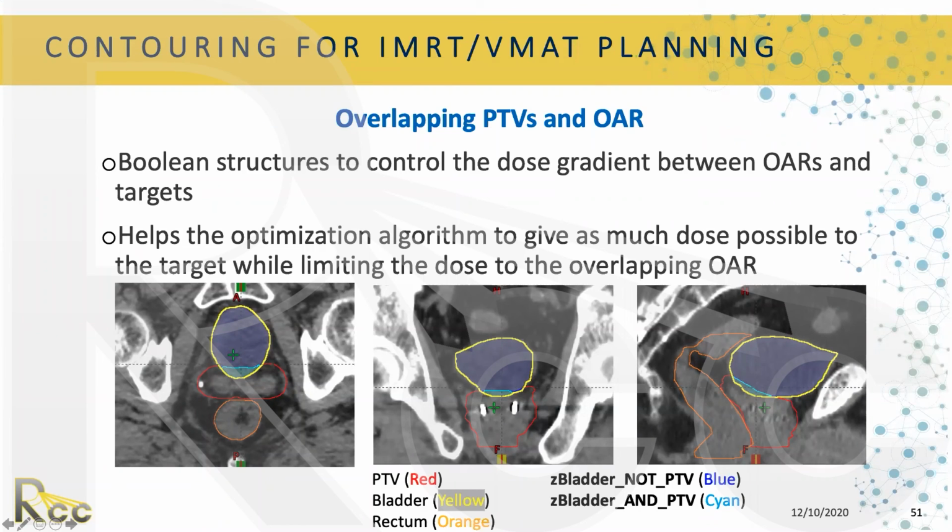Of course, there's going to be a little bit of sparing in the isodoses because of the bladder constraint, but sometimes it helps. Again, you don't have to do it if you created those VMAT shell structures or VMAT ORs that I told you about, but sometimes it's another technique and it is very well used in many places.